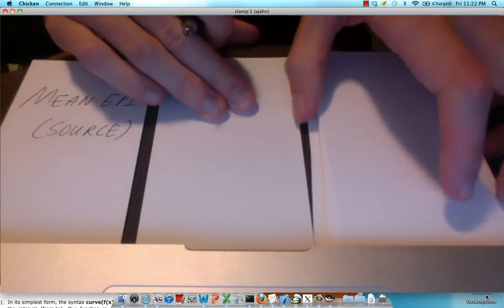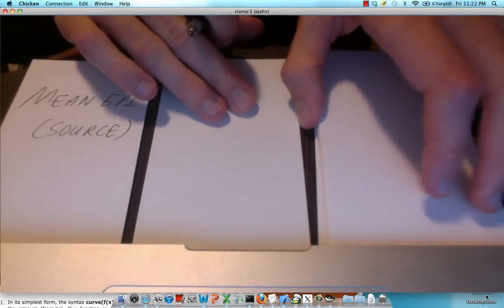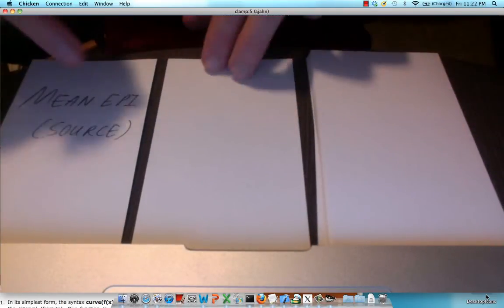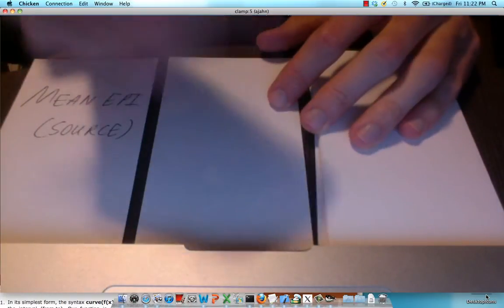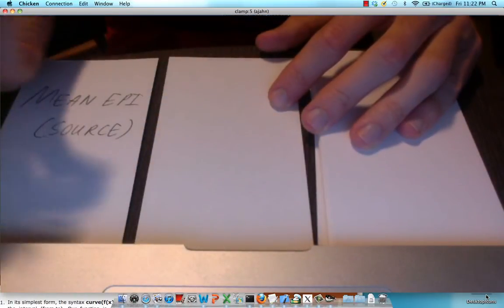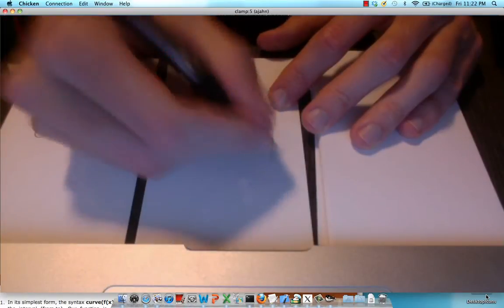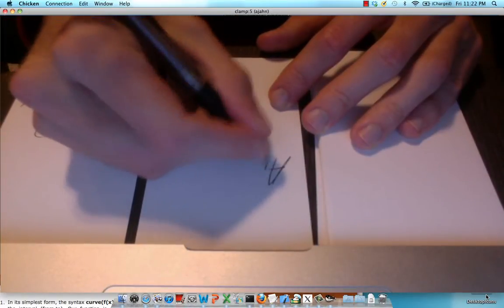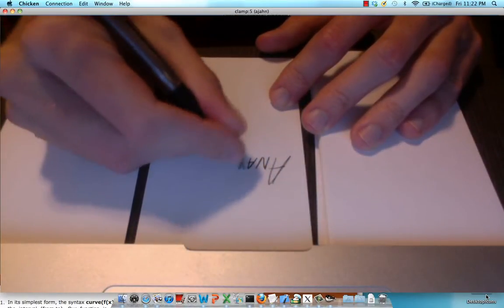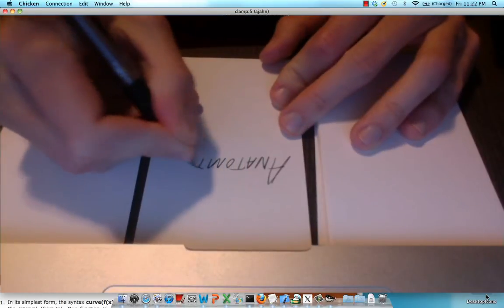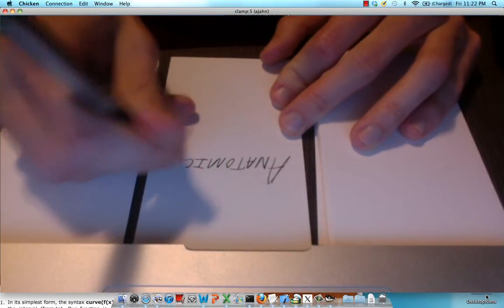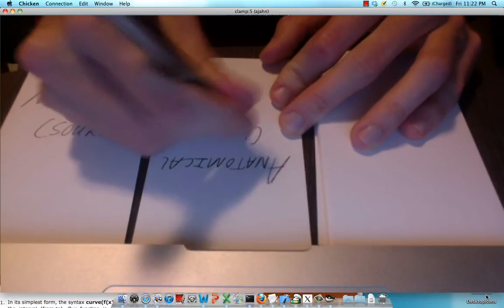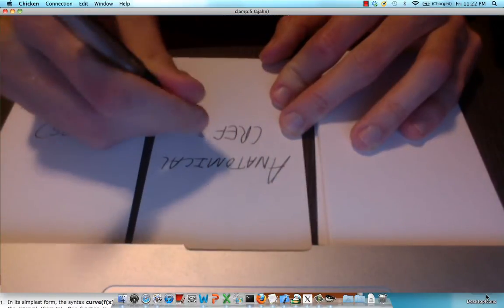Now we also need what's called a reference image or another modality that's going to be aligned to this mean EPI. Usually that's going to be our anatomical image or our T1-weighted image. So we'll call this the anatomical and it will be the reference image.